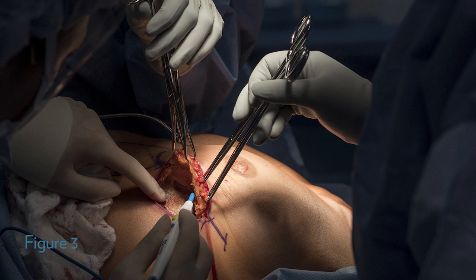In figure three I am performing the initial dissection of the breast tissue off of the muscle. I prefer to take the specimen off of the pectoralis muscle first as I feel that this approach preserves the blood flow to the nipple for a longer period of time and is less traumatic on the skin flap. I use Adair clamps to grasp the tissue and the skin and then I use electrocautery to dissect down to find the pectoralis muscle. It is important to note that the incision may actually be below the inframammary fold to achieve the desired cosmetic outcome, which may change the direction of your dissection.